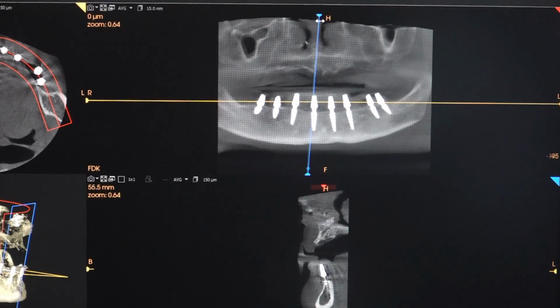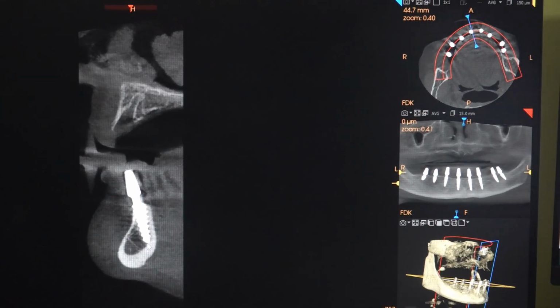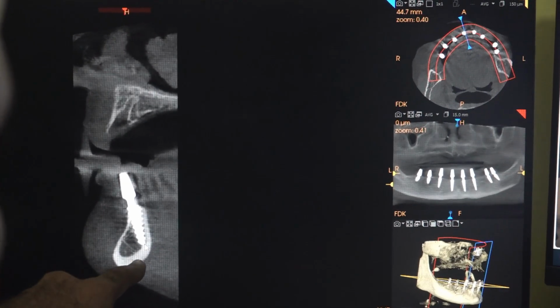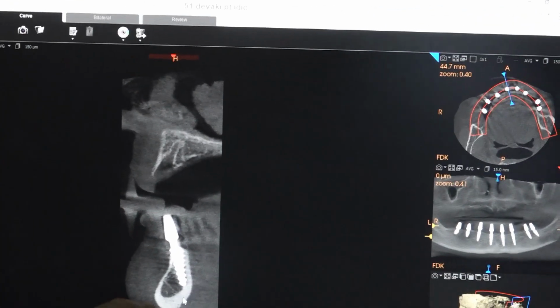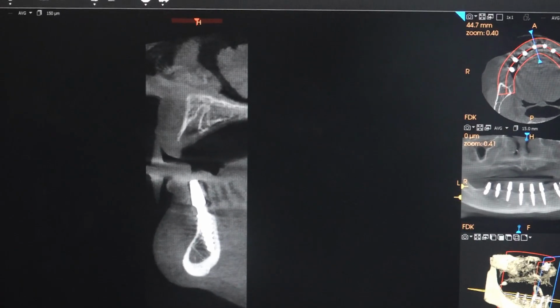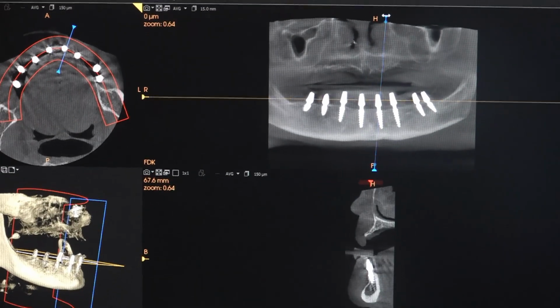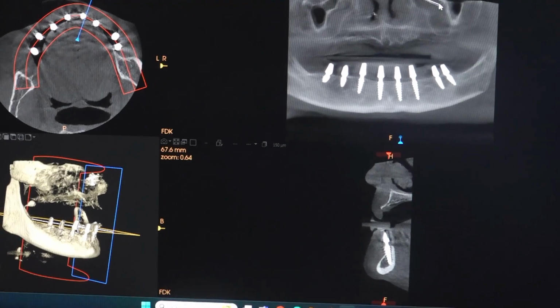So anteriorly, the golden rule is respect the resistance of the drill. Here, when I drilled, the drill was touching here. I didn't push violently and perforate here. So this length I selected is perfectly fitting. This is 3-2. Okay, it is also correct.